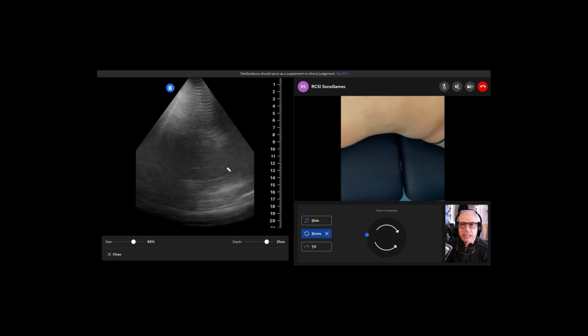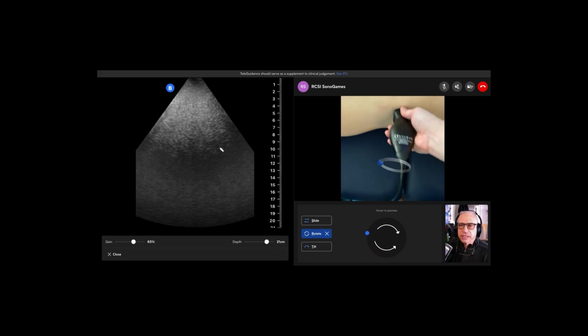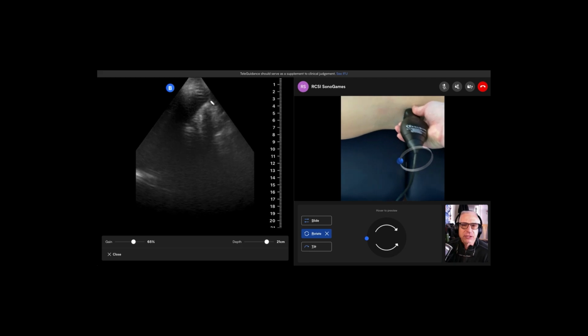These transducers need a lot of gel. Last week Greg was covered. That's fine. Yeah, just pour it on his chest. You don't need to pour it on a transducer. It's inefficient. Bladder. Right? This is trauma, man. You don't have to worry about that. So he's a trauma patient.